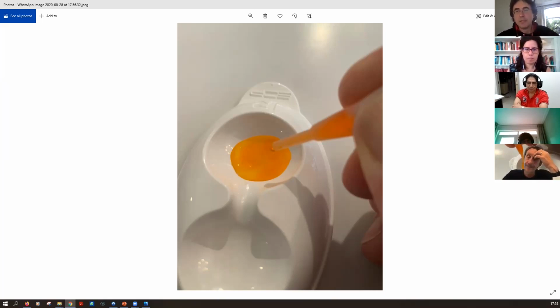Awesome. Thank you. Yeah, this is absolutely spot on. It is really making a huge difference if you get this right. And quite often the practitioners in our family of ESP users, where they really have this nailed down, get fantastic measurements on a very consistent basis. So keep us informed of your feedback. This is something we really love to support, this discussion around it.